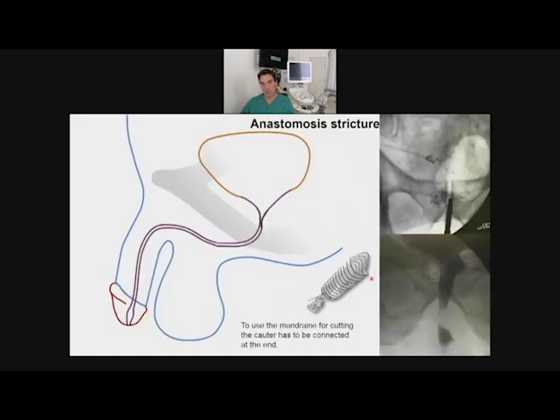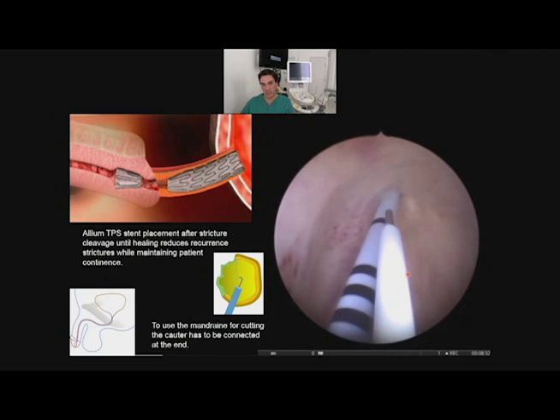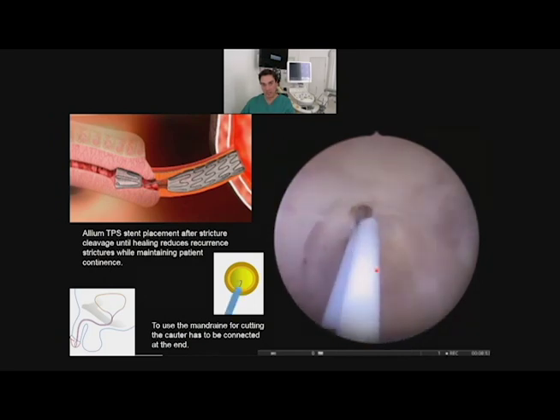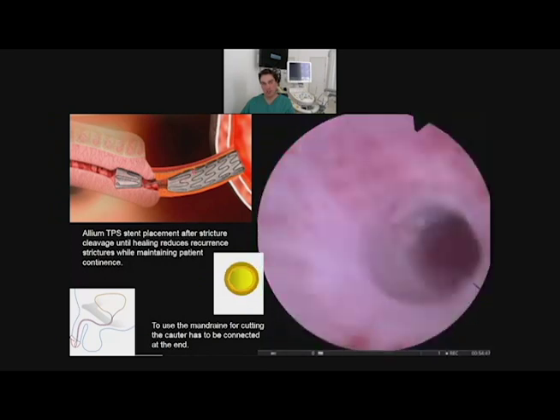If you have a stricture after radical prostatectomy on the frontal side, you see here a lot of clips after treatment, we do it in the same way. We do not only cut the stricture, we go with monopolar, we open it straightforward, and then at the end we put a stent inside, but in these cases we use an RPS, a round stent, not a prostate stent.